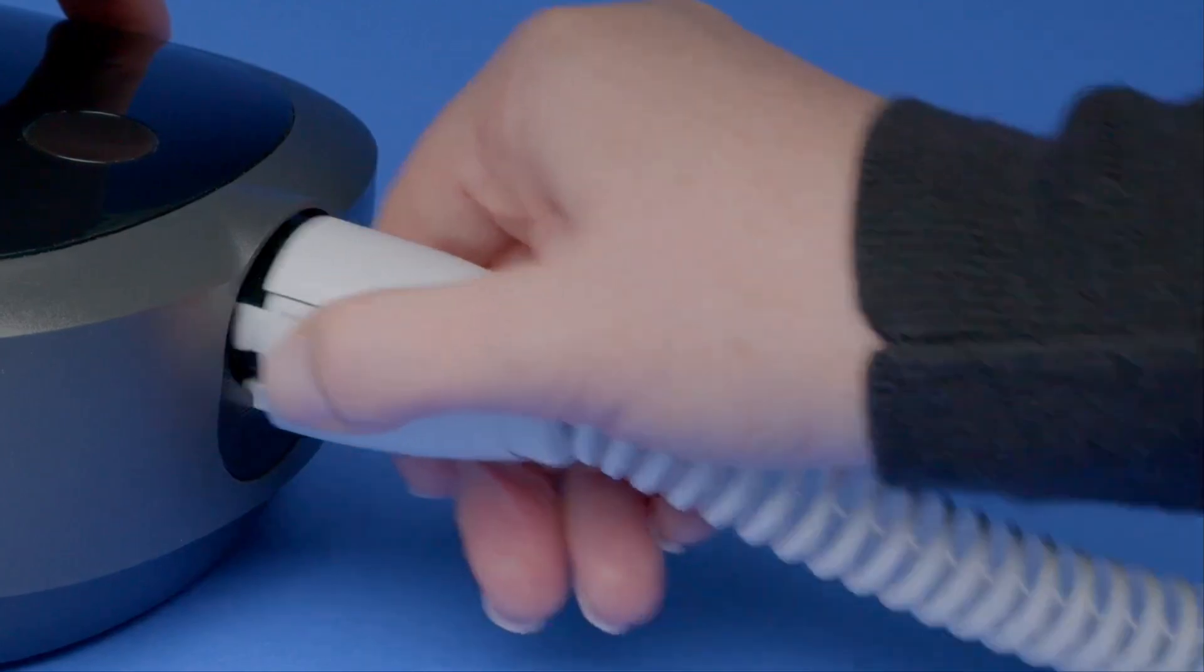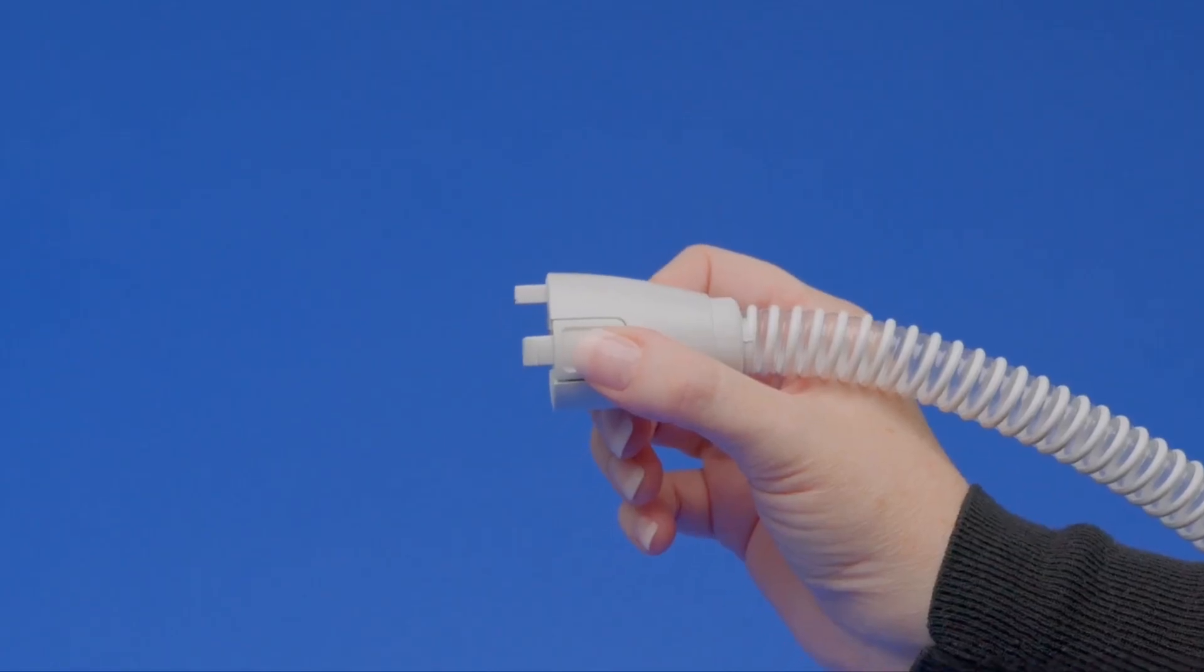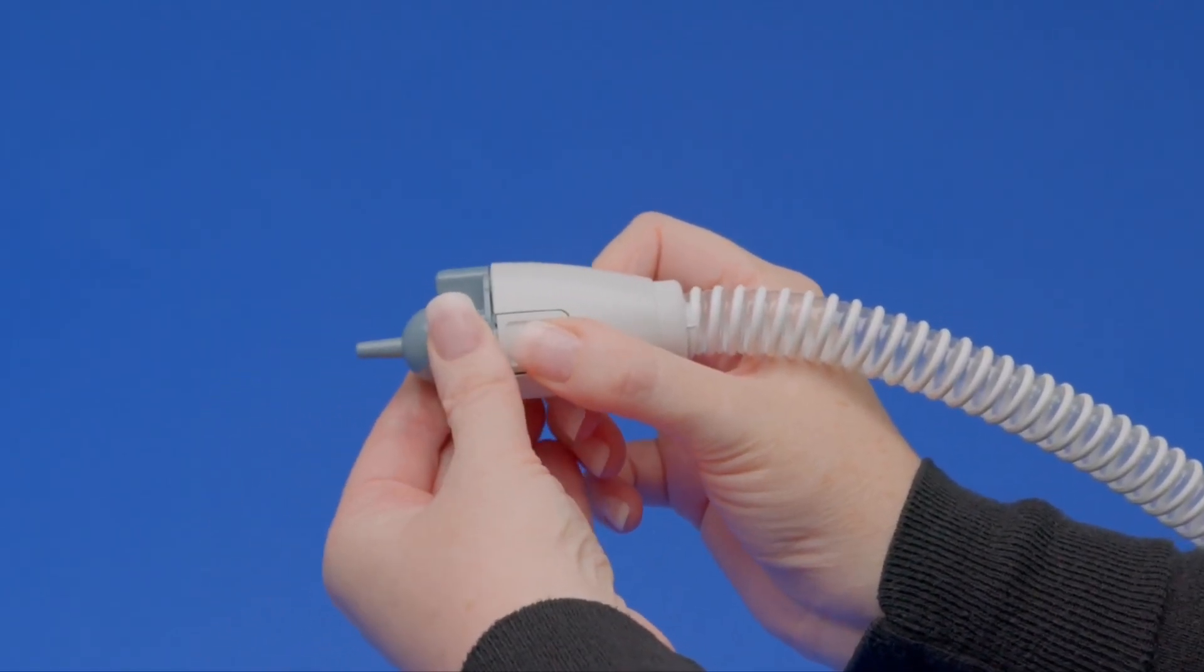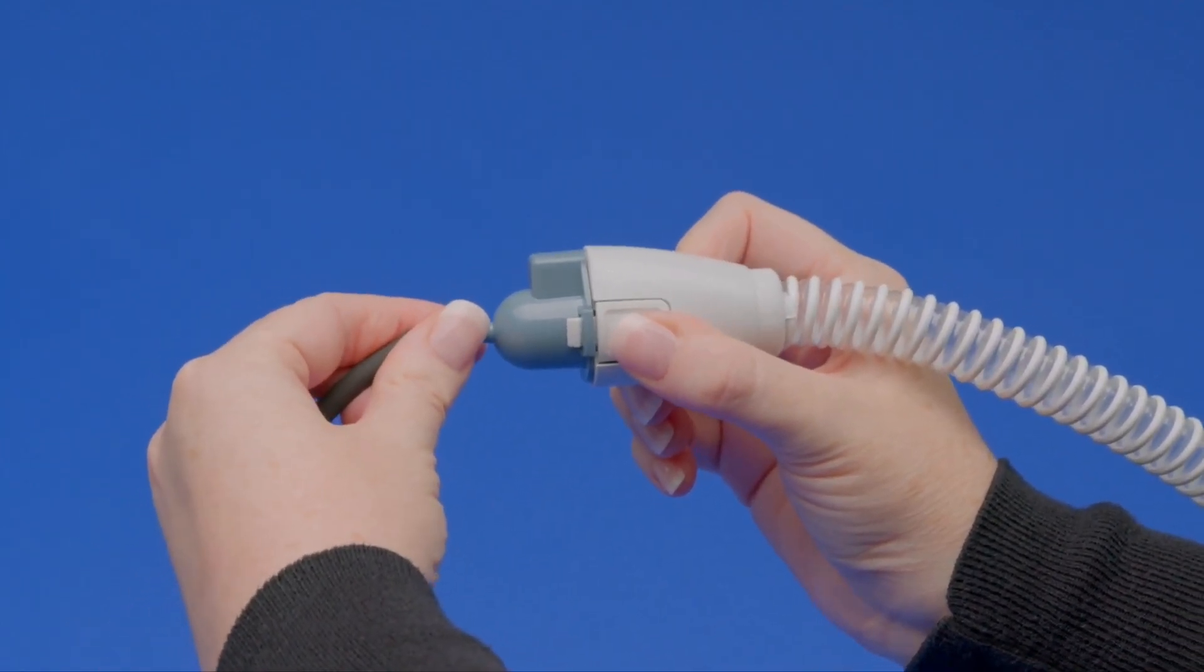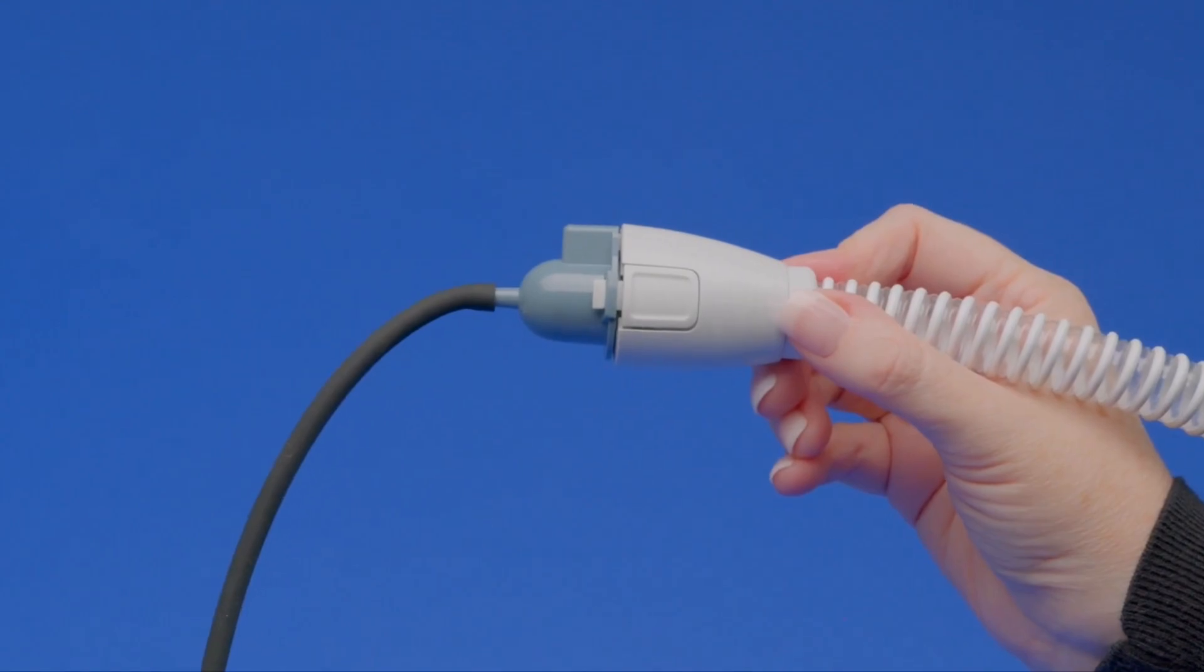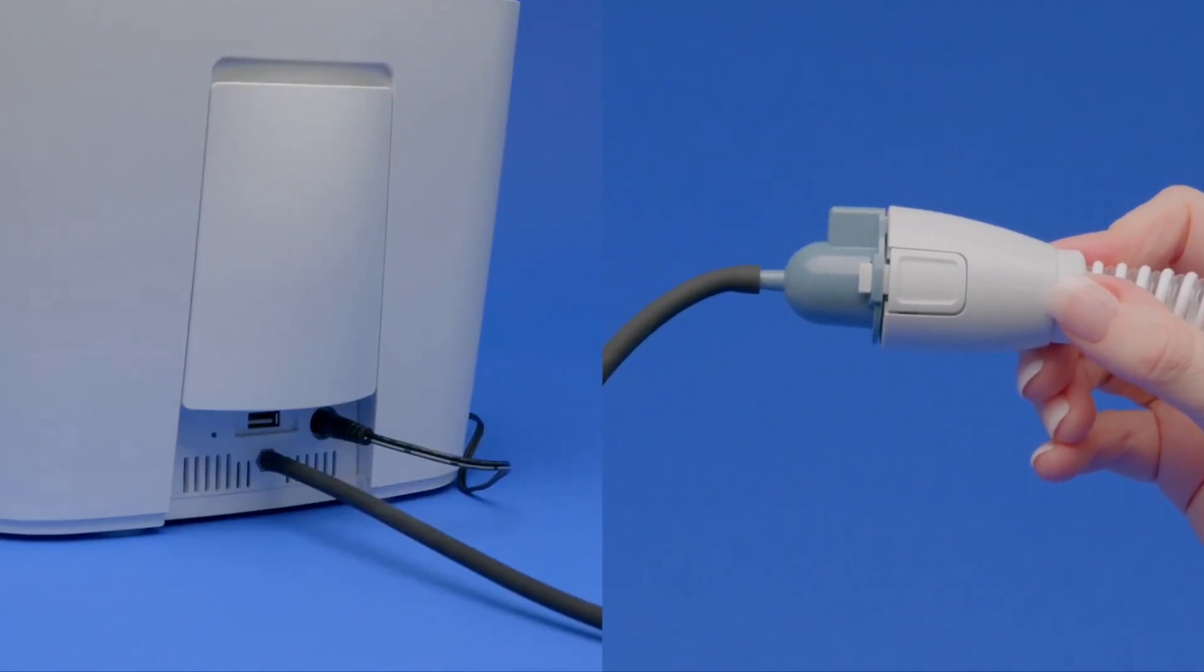Remove the CPAP hose from your sleep equipment and install the SoClean adapter onto the end of the CPAP hose. Connect the free end of the black ozone tube to the nozzle on the SoClean adapter. The other end of the ozone tube must be connected to the back of the SoClean.